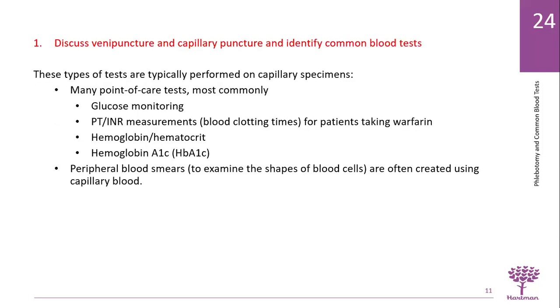So there are types of tests that are typically performed on capillary specimens. When we say capillary, we're referring to tests that are done at the bedside. Capillary means sticking through the skin, like through the finger, the third finger, or through the heel. And these are all typically tests that are done at the bedside, like you walk up to the patient's bed, just let them know who you are and what you're there for. Those are typically called point of care tests when it comes to drawing labs.